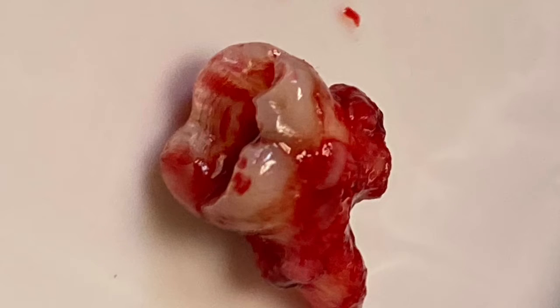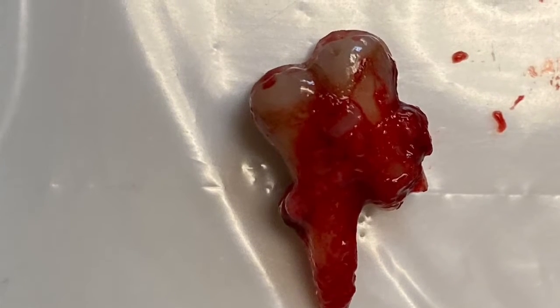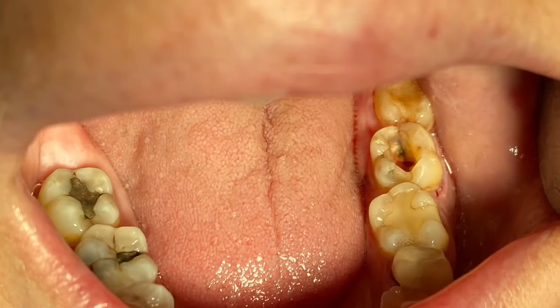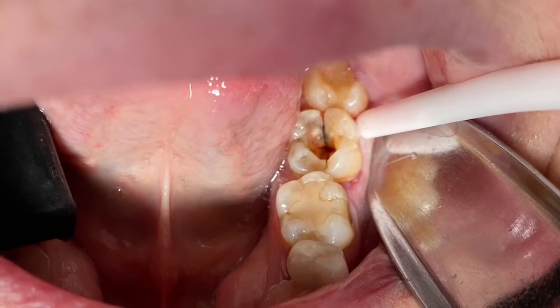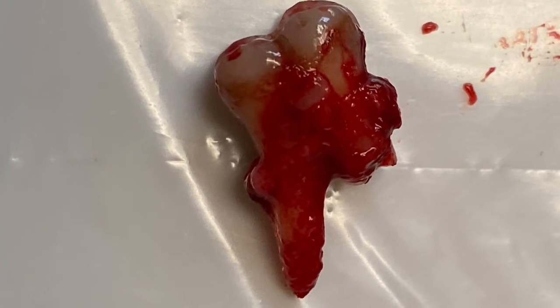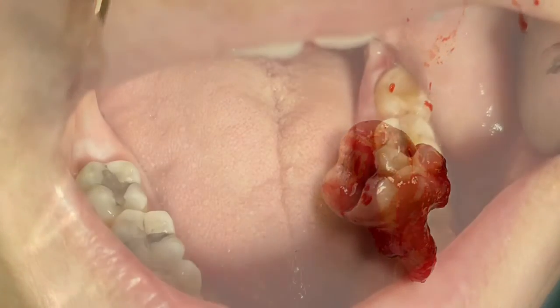It requires you to do several steps to identify the situation, from perio probing, the cold test, the tapping test, all of those tests. In conjunction with that, when you see a clinical fracture of the enamel, you have a 50-50 chance, and you should explain to the patient that the fracture could be above the pulp chamber, above the root surface, or below. If it's below, it's too late to save. In this situation, we explained everything before we started, and I showed the patient the mirror. The patient agreed that this tooth cannot be saved, and we went ahead and took out the tooth.